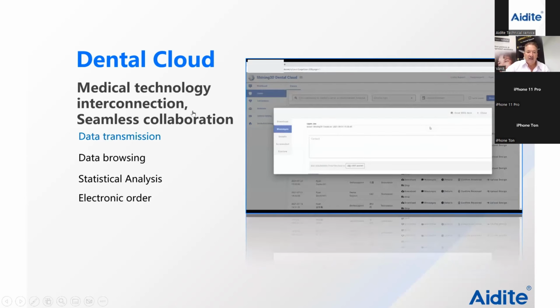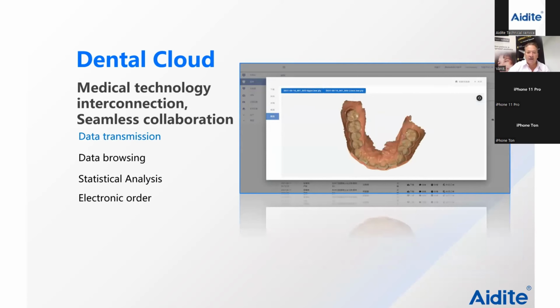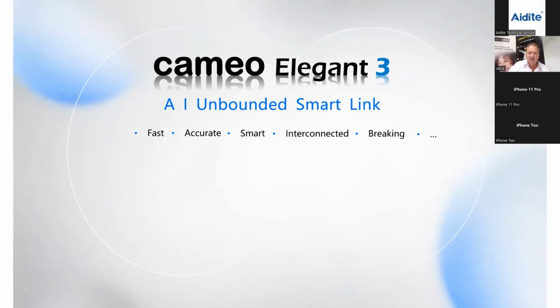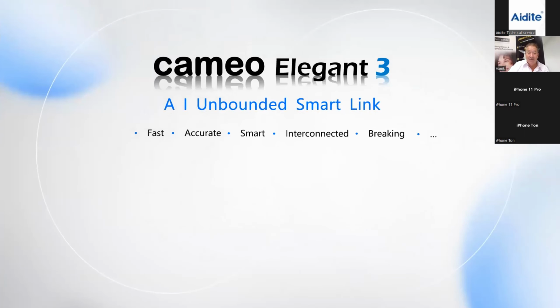Okay. Then the dental cloud is the way you would send your case to the laboratory, and the laboratory can basically open it. In the dental cloud, you can see information, statistics, and those kinds of things. But again, we are not interested in this. What we want to do is just scan and start doing our crowns and bridges in the laboratory.